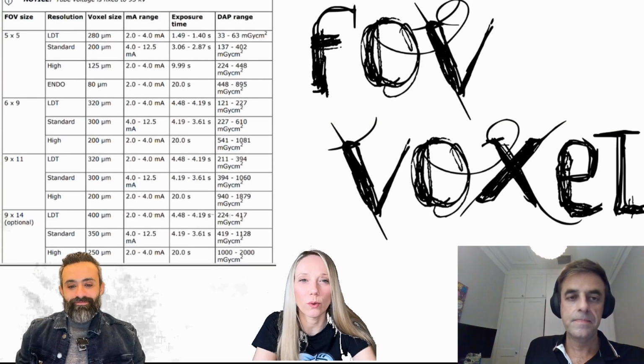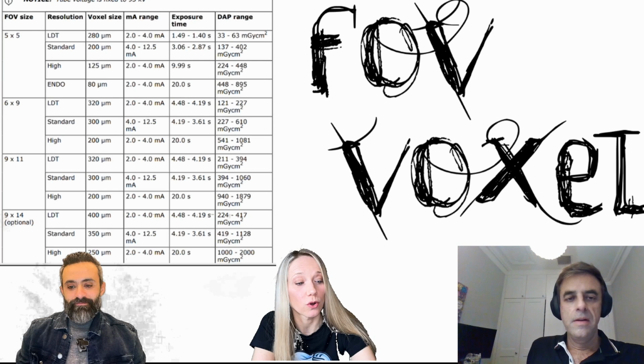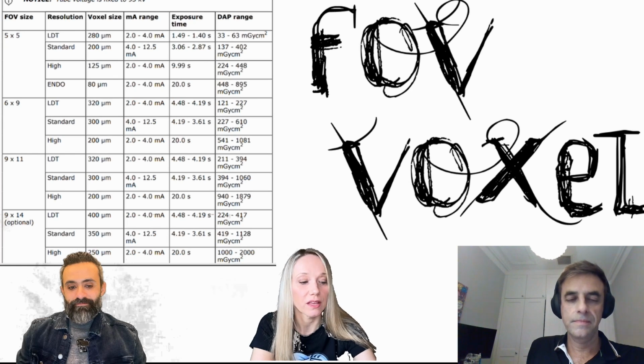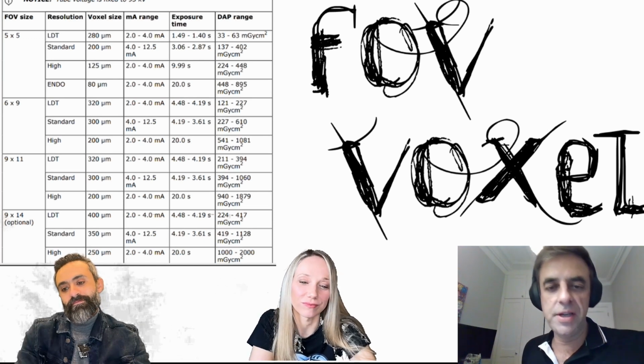But when it comes to CBCT, we hear a lot of terms when we talk about the parameters, and so we know like the voxel size, field of view, and resolution, etc. How can these all be related, and all these values, what do they tell us? Yeah, so that's a good question, Francesca.